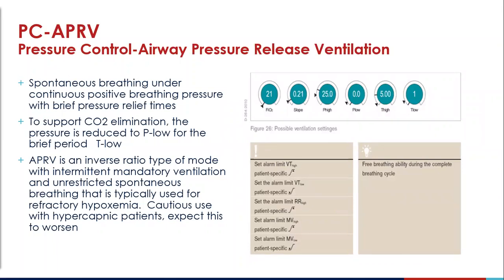PC-APRV, which stands for Pressure Control Airway Pressure Release Ventilation. Spontaneous breathing under continuous positive airway pressure with brief pressure relief times. To support carbon dioxide elimination, the pressure is reduced to a pressure low for the brief period of low time.